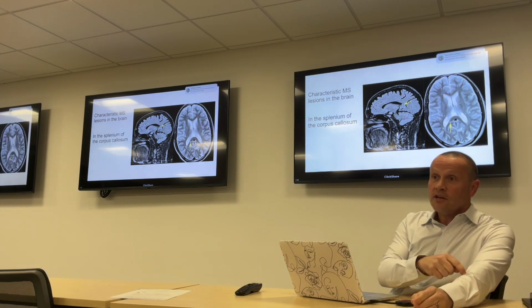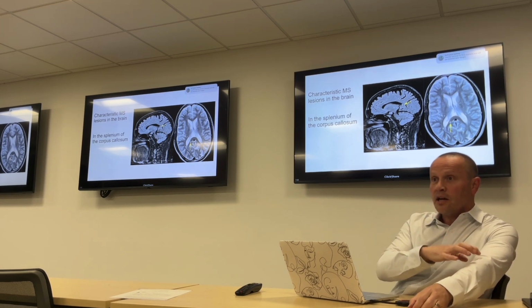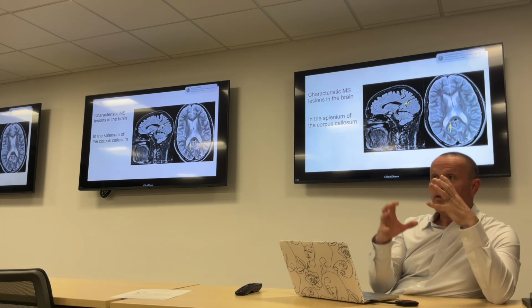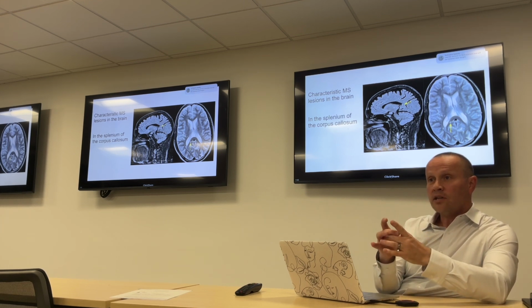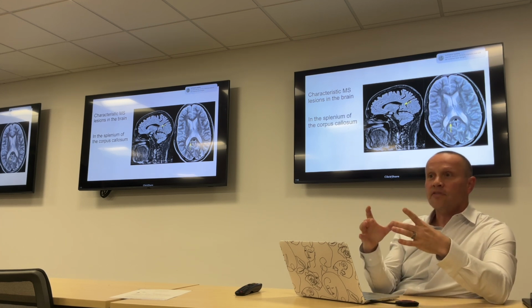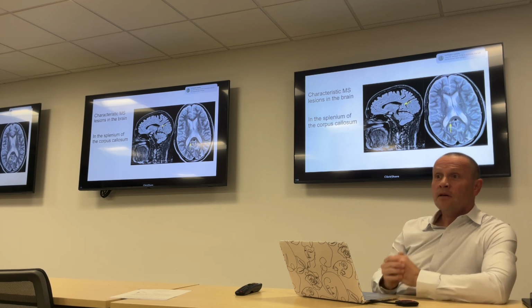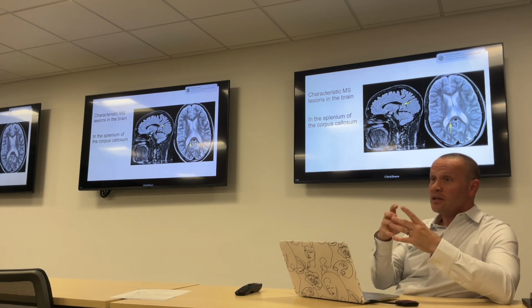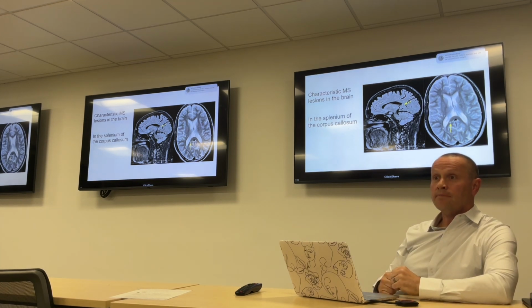It's kind of like, if you cut yourself, sometimes you get this acute inflammation, it swells up, or a bruise, it gets big initially and then it quiets down over time. The new MS plaques tend to be bigger. Over time, once they age and once they might be treated effectively, they'll shrink down, so they're not actually causing any mass effect in the brain. They're the same size as the brain was initially. It's like a little scar. But the new ones are definitely usually bigger. They look kind of angrier. They can enhance, and they can sometimes even cause a little bulky mass effect. They can push on things nearby.